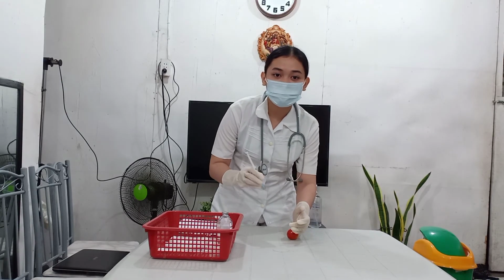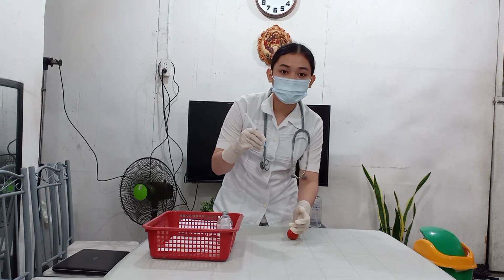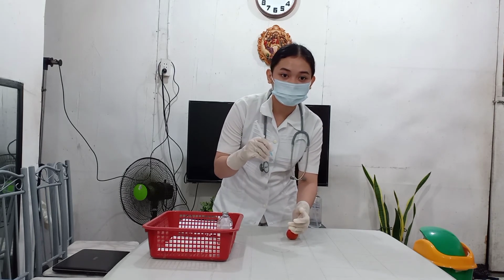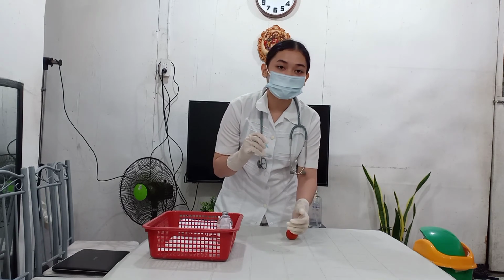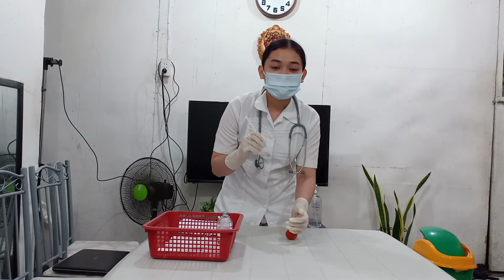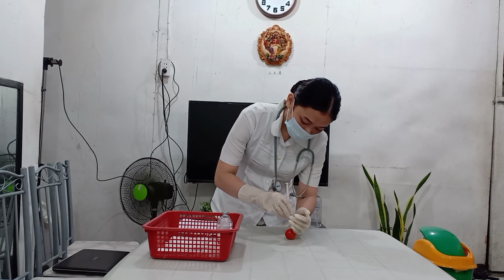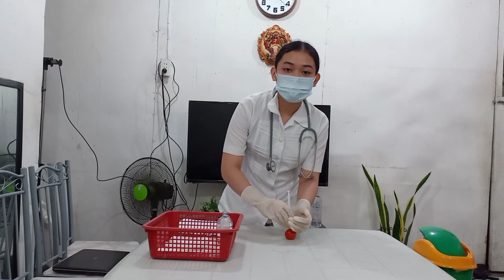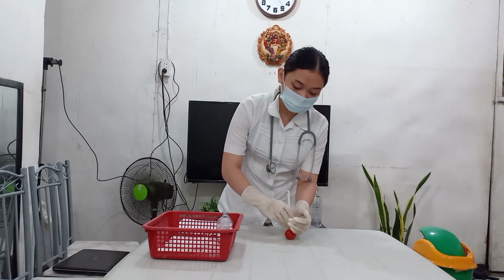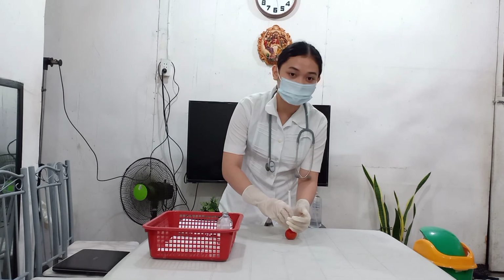And then, we hold the syringe between the thumb and forefinger of the dominant hand. And then, we inject the needle quickly and firmly at a 90-degree angle and insert the needle into the muscle. The position keeps my fingers off the plunger, preventing accidental medication loss while inserting the needle.